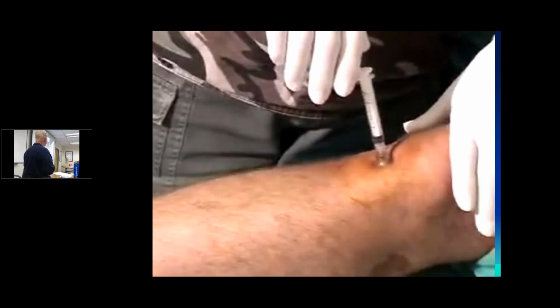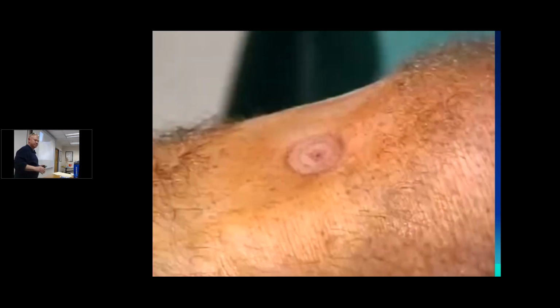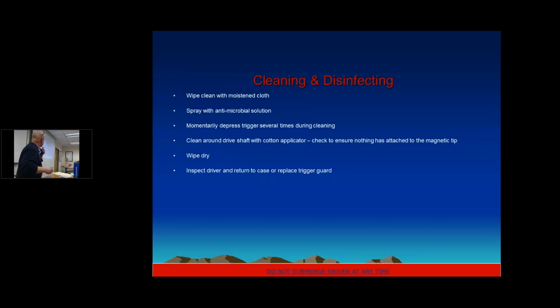Okay, we're going to use a technique of holding the leg. So he's pulling it back out now when we twist. Does he twist clockwise or counterclockwise? I think you say clockwise. No. If you have the lock on there and you're twisting counterclockwise, isn't that just going to come off of that lock? Typically, it does very well just by pulling it out that way. Then comes cleaning up afterwards, making sure it's good to go for the next round.